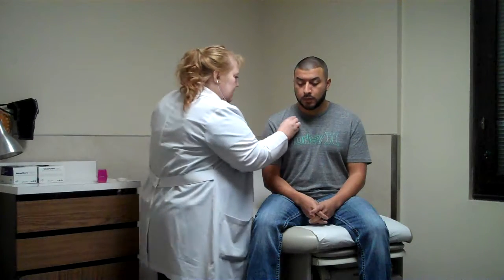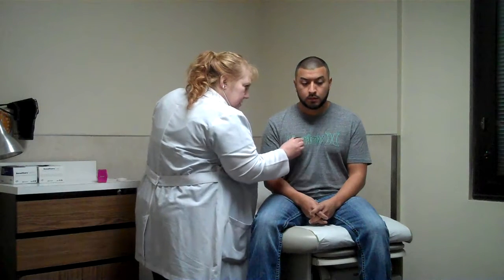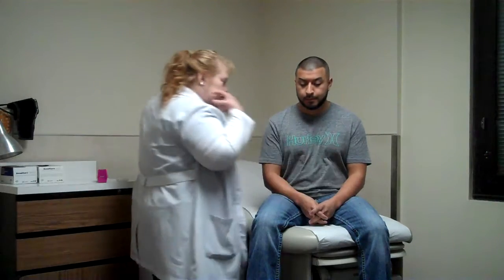And we've got one more test. It's called egophony. And what I want you to do with this is every time I touch you with the stethoscope, say the letter E. E, E, E. Good job. Now I was listening to see if it switched from an E to an A. And if it did that change, then that would also be a sign that there could be some consolidation, which your lungs were clear. Very good.